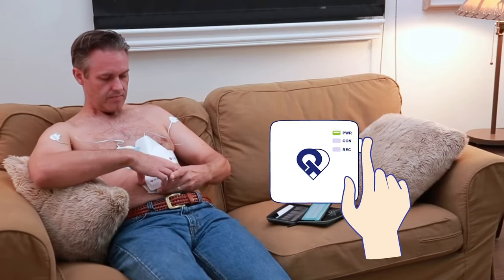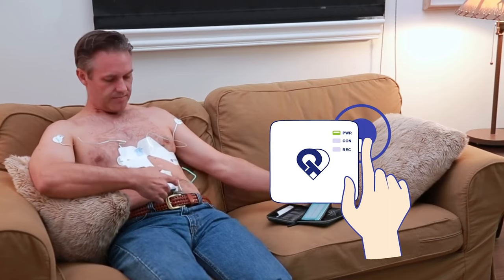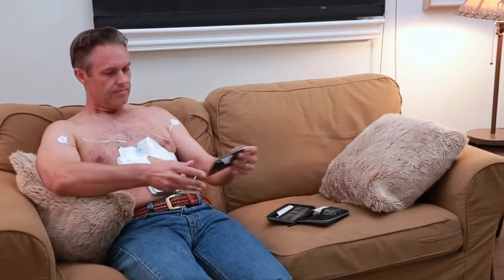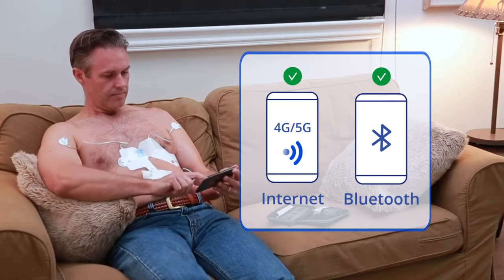Turn on the PCA 500 recorder by holding the power button down until the lights on the front begin to flash. Place the piece of gauze provided between the recorder and your skin. Make sure your smartphone or tablet is connected to the internet and Bluetooth is enabled.